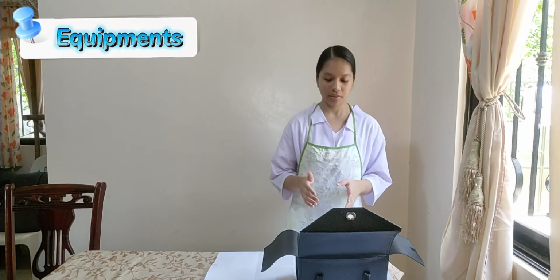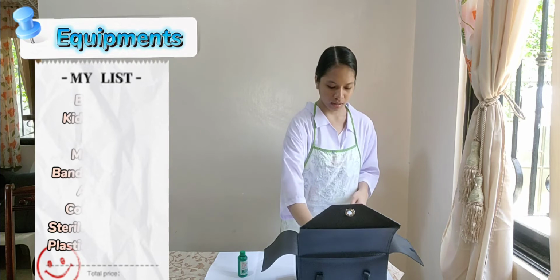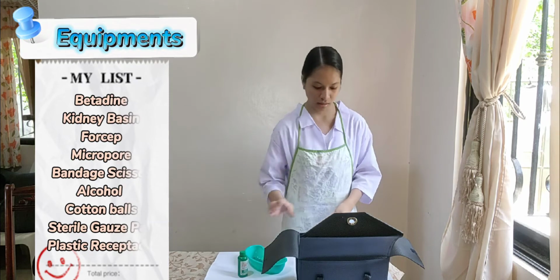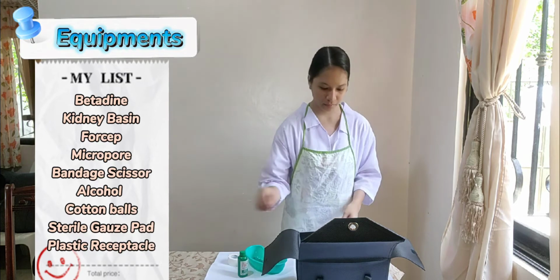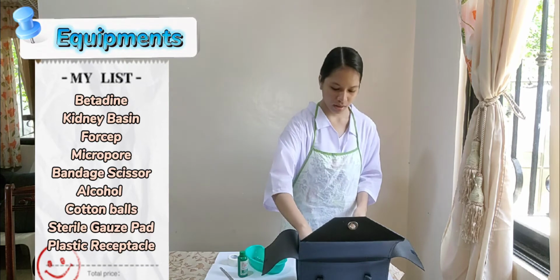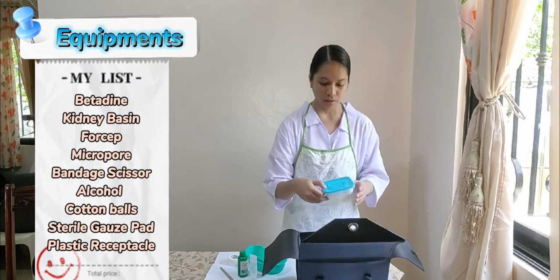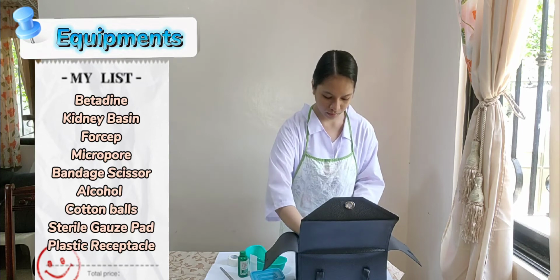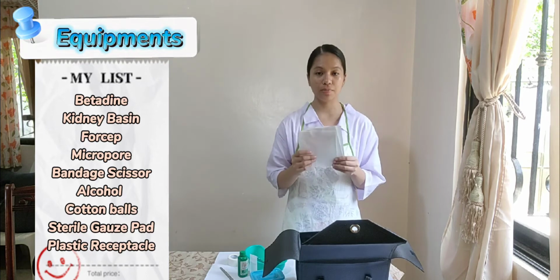The equipment are betadine, kidney basin and forceps, micropore, bandage scissor, alcohol, cotton balls, and sterile gauze pad.